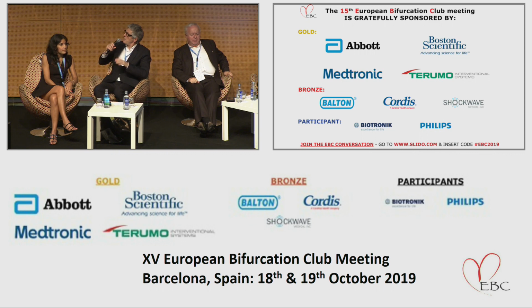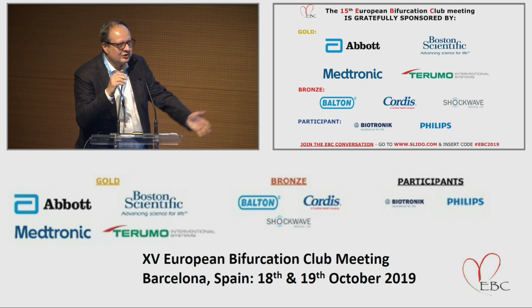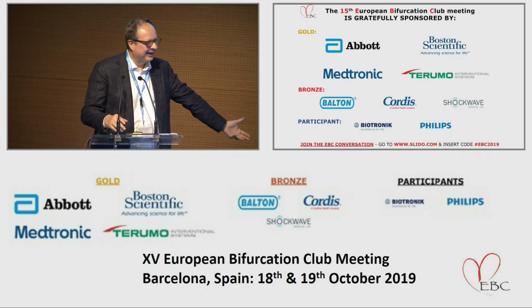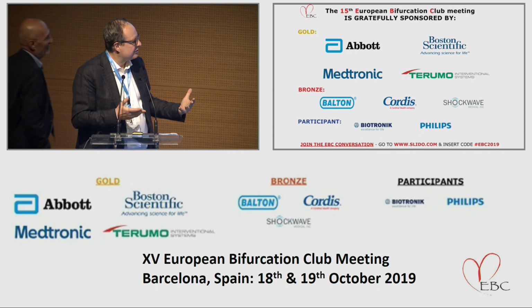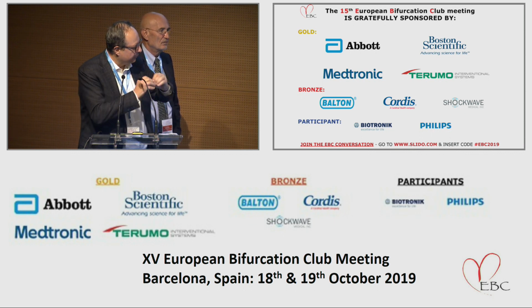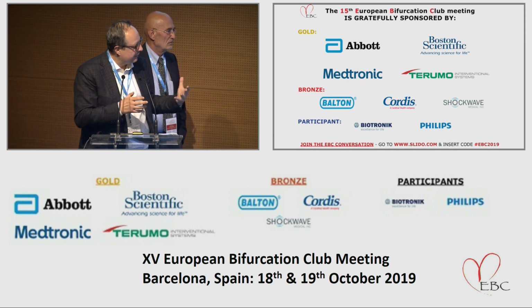So Vladimir, in which cases are we doing a crush instead of a DK crush? I do the DK crush. I don't do the crush personally. I gave you my disclosures before. Yes, this is an argument, but in looking at the literature critically, this is what I'm finding. I use a DK crush because I find that very predictably it gives you complete coverage of the ostium and the best opening. The crush techniques do.